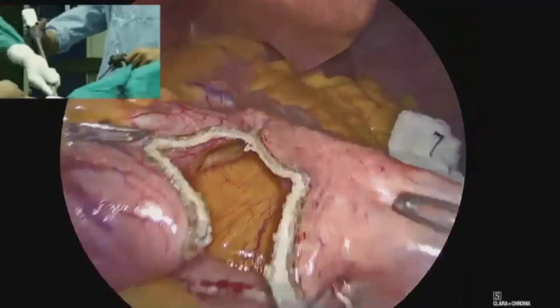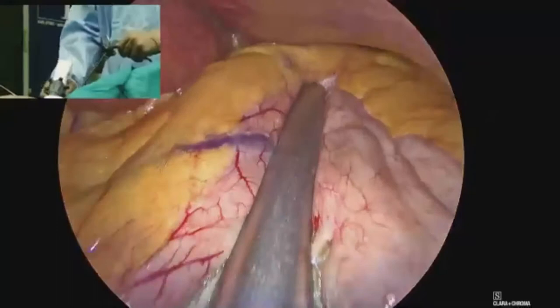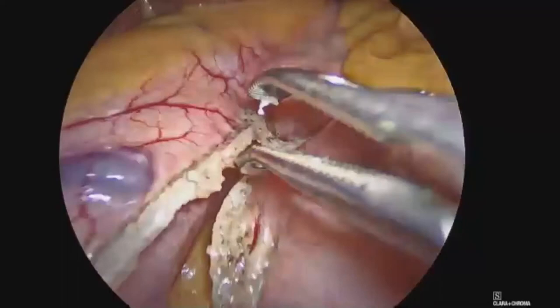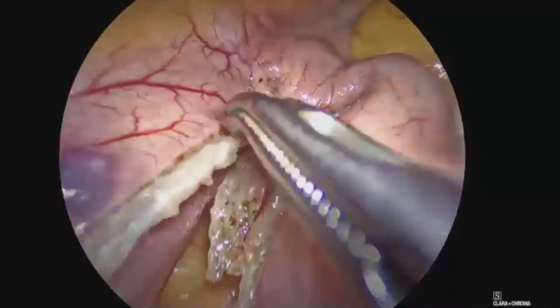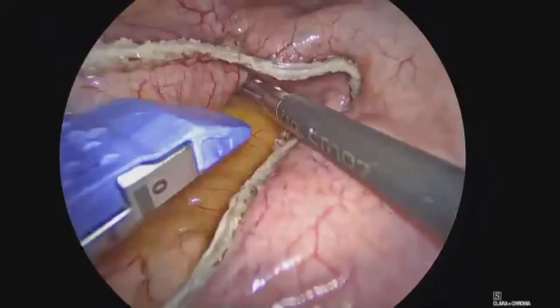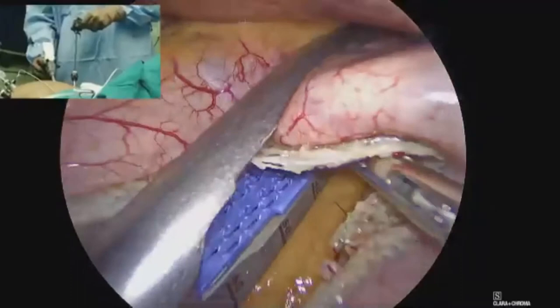So that's what is going on. At the end of the procedure, once I perform the anastomosis, I'm going to demonstrate the endoscopic finding, what intraoperative anatomy we created, and how it looks on endoscopy immediately postoperatively. We also check for bleeding, some oozing inside, and if we have some oozing from the site of the anastomosis or the area where we fired the stapler, the junction between the small bowel and the stomach. So that's what we have to see.